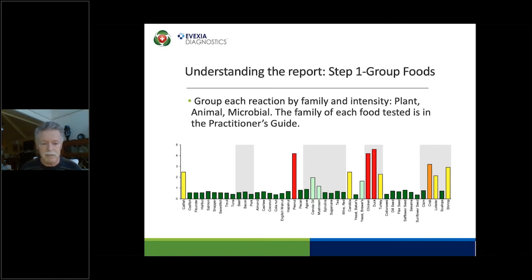Again, it's the same sort of concept. What I wanted to highlight here was this particular individual on the right-hand most side: crab, lobster, and shrimp. They are very closely related in proteins. So the person could say, well, I consume shrimp, but I don't consume lobster or crab. That would be a cross-reactivity. If they say, well, I eat all of them off and on, then most likely the explanation is these are consumed on a fairly regular basis, and what we're picking up is a true reactivity against that particular food.